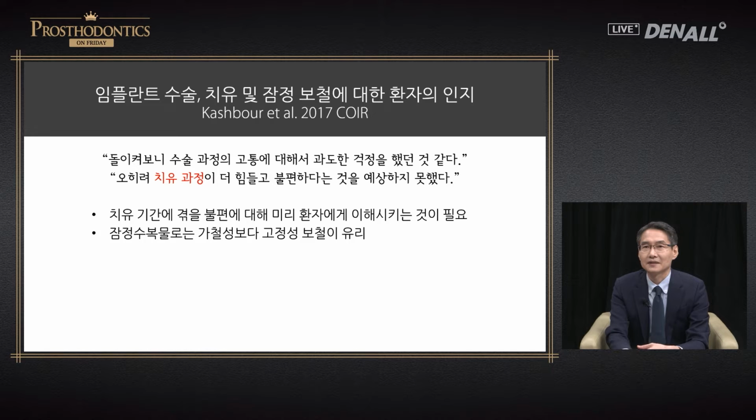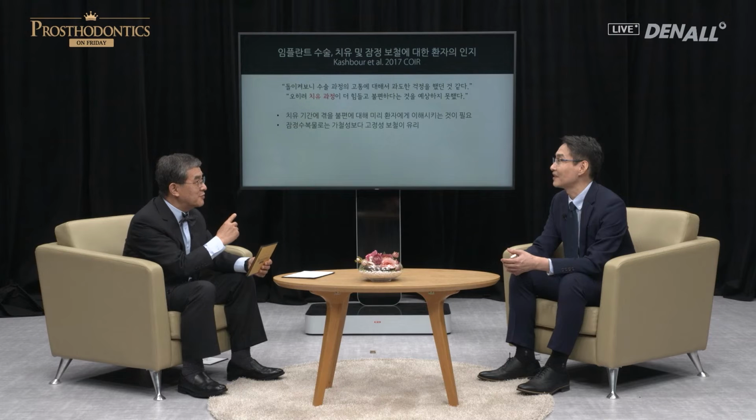And when we provide temporary restoration, it is recommended to use the fixed prosthesis rather than removable prosthesis. Koreans, they tend to rush, and as for implant treatment, you need to wait after implant placement, and we cannot rush the process, and we need to explain this thoroughly to the patient.